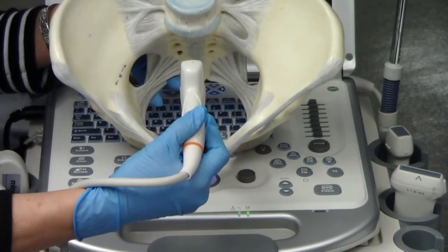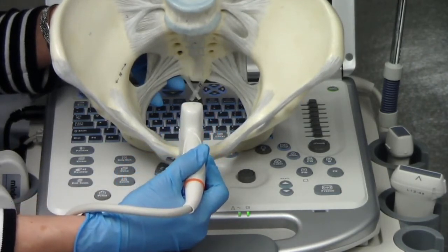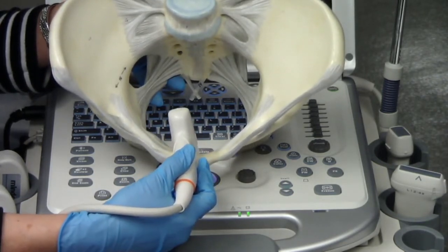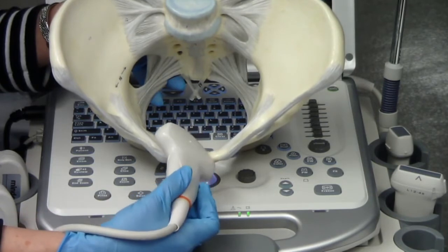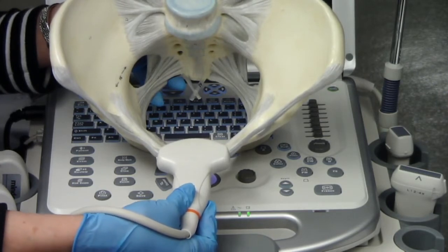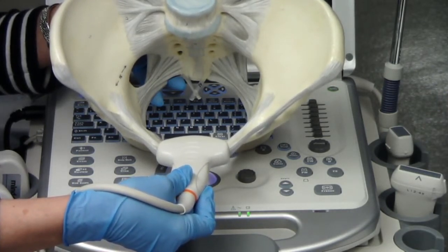So when we're starting just underneath the umbilicus, we slide down to the pubic symphysis. And then we toe the probe so that we can look straight down into the true pelvis. And same when we turn the probe in transverse, we put it right up against the pubic symphysis, and then we aim that probe towards the contents of the true pelvis.